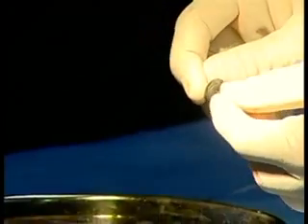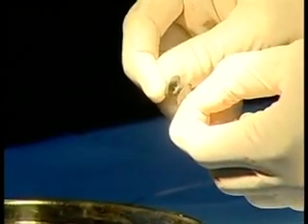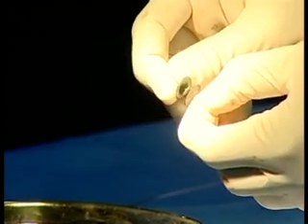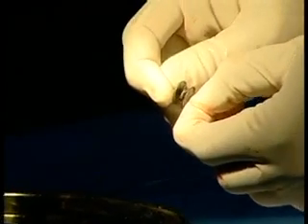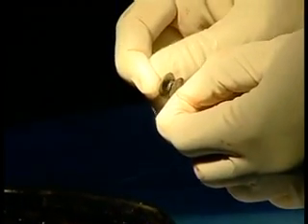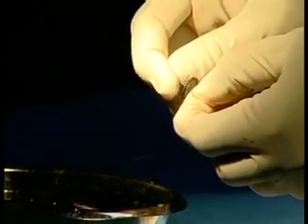Can you stretch it? I am stretching it. It has got 2 disks. The central waist measures 4 millimeter length, whereas diameter is 6 millimeter. Either side of the central waist you have the LV disc and RV disc, supposed to be the PA disc and aortic disc, which measures 12 millimeter for the 6 millimeter device.